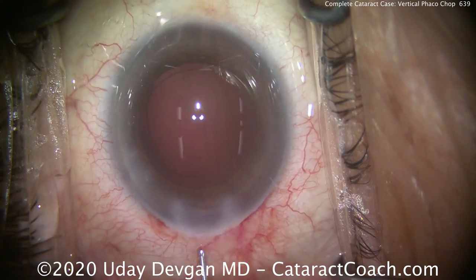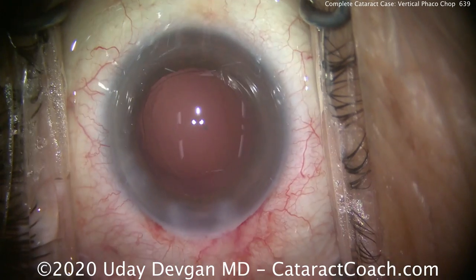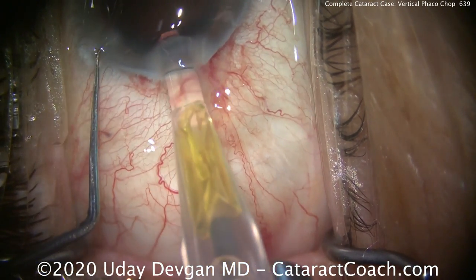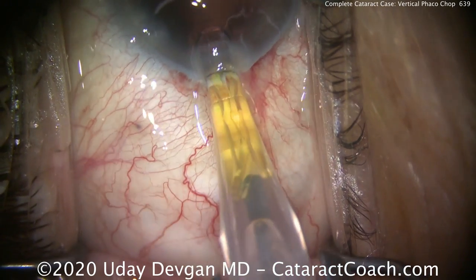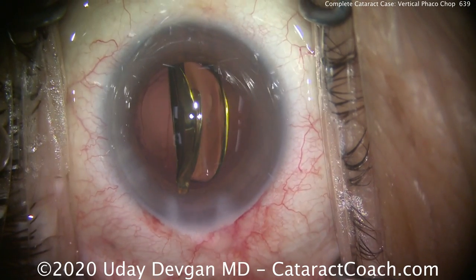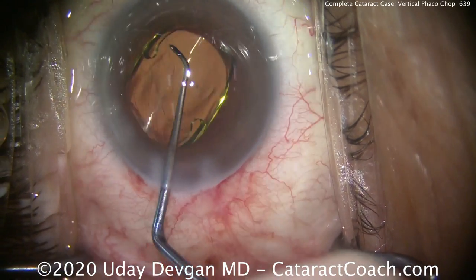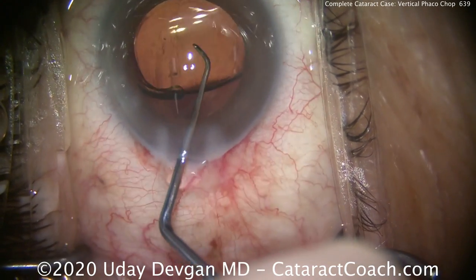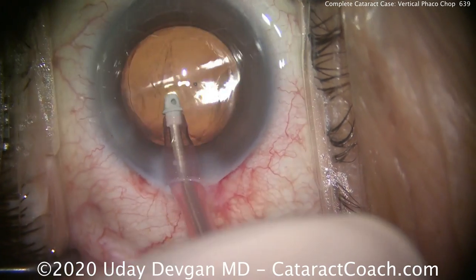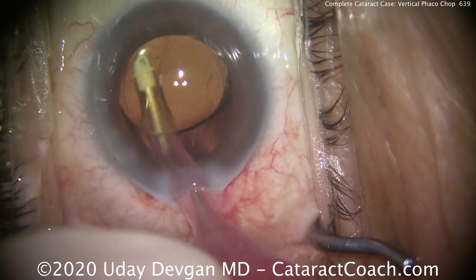Now let's inflate our capsule bag with our cohesive viscoelastic. There you go, that looks great. And now let's get that IOL well into the capsule bag. Here comes the lens — a little bit of counter-traction there, get the tip in. This is a little bit of a tight fit because of the small incision, and we'll deliver that lens. We're using the D cartridge — D like dog — that's a smaller tip cartridge able to go through the smaller incision. Putting the lens in the capsule bag, let's rotate it around, get those haptics to open up. And you can see that's a real nice overlap of the optic by that rhexis — about a 5.5 millimeter rhexis. Going behind the IOL, let's clean up all that viscoelastic, and we're just about done with this case.